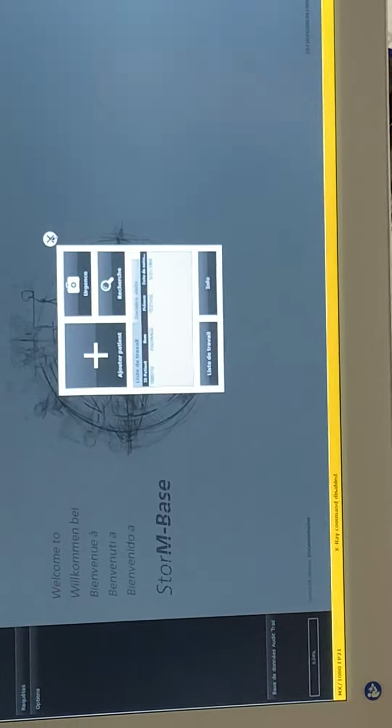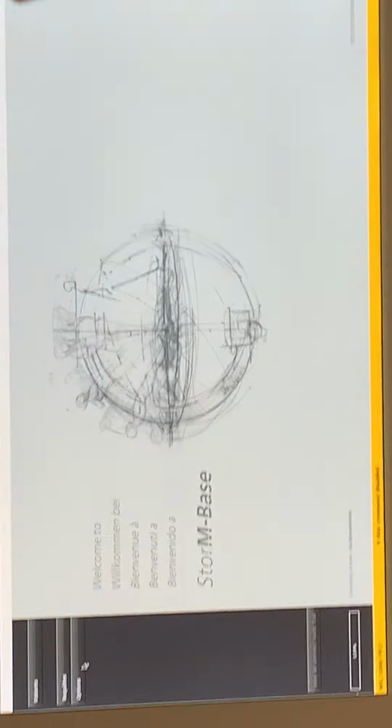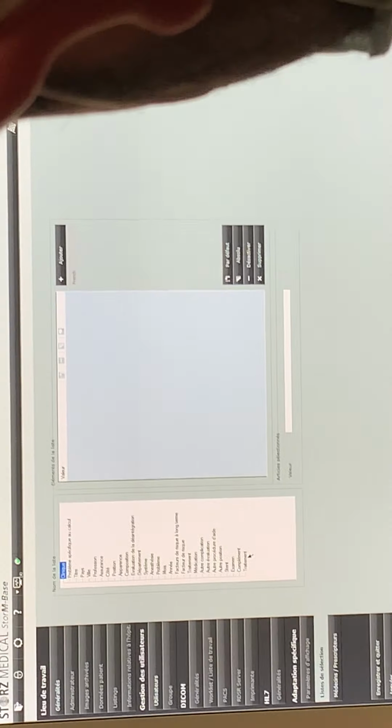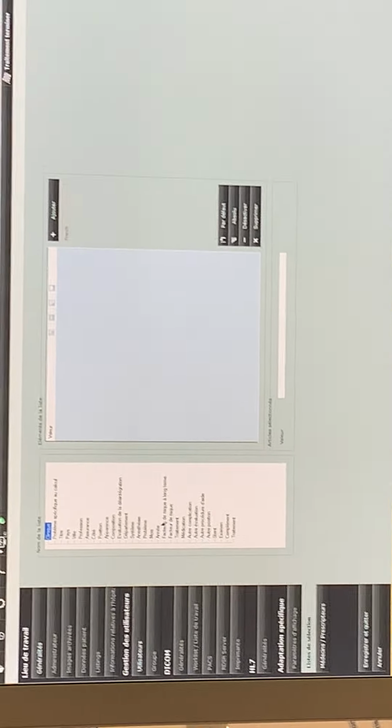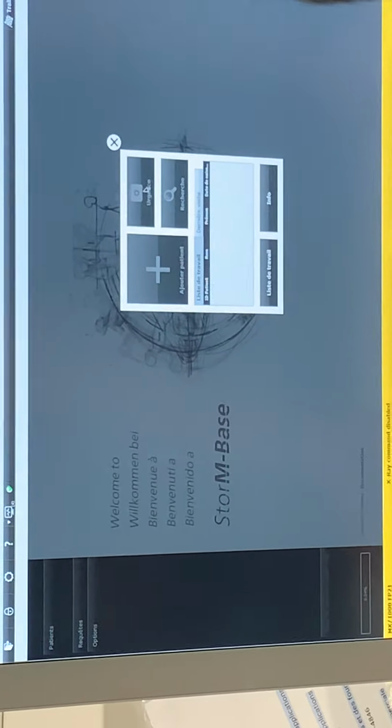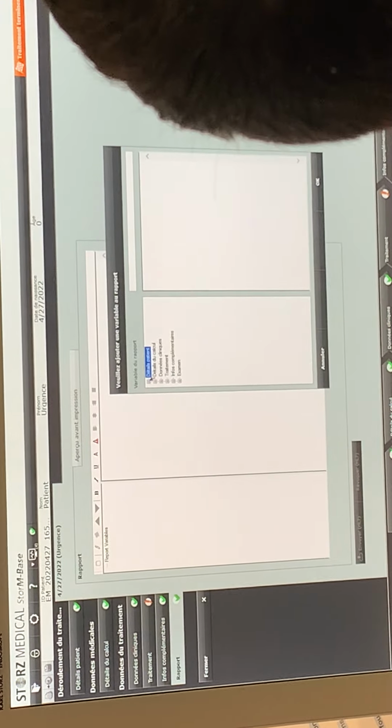If you press X here, you can go to options, list the selection, and I need to check exactly where I can do that. I need to check as well because it is possible to make a template, but I need to check how. Tomorrow. Can you try with Lieberman tomorrow? I'm gonna text Dr. Lieberman to do the new one here tomorrow.